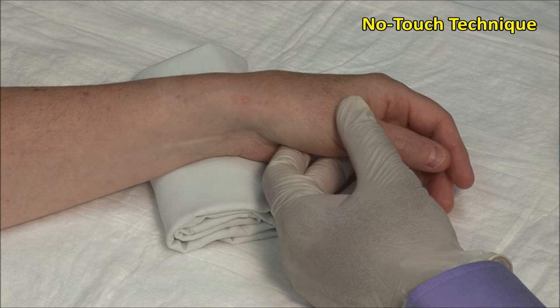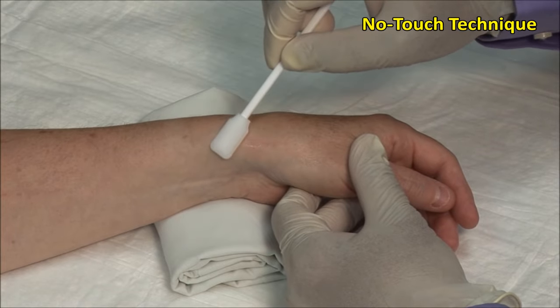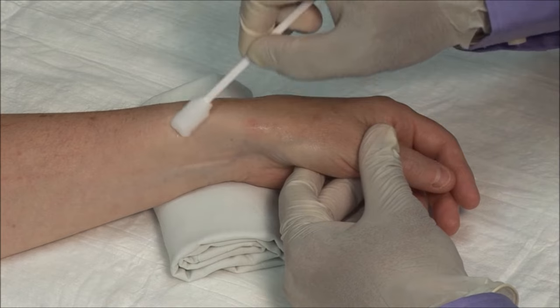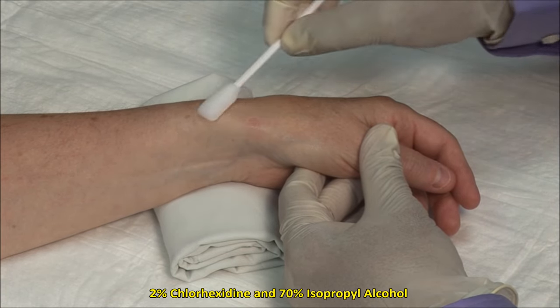A no-touch technique is used, meaning that once the area is cleaned it must not be touched with anything but sterile needles. Scrub the site and then clean in an outward fashion. Here I am using 2% chlorhexidine and 70% isopropyl alcohol.